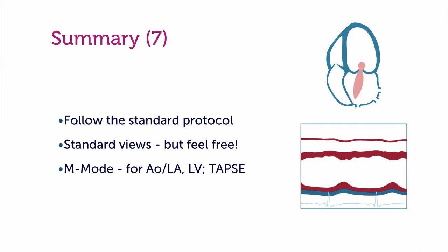When it comes to M mode, don't forget you should follow the standard protocol. It's important that you can measure here. It has a very high time resolution, so the M mode is certainly something that is important. Don't forget that we can also use the M mode in other situations, for example, to measure right ventricular function with the help of the so-called TAPSE.